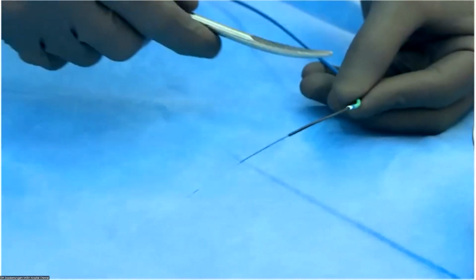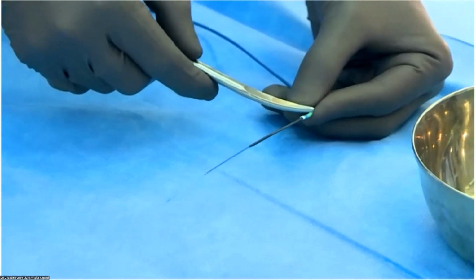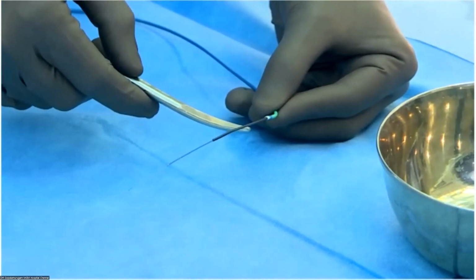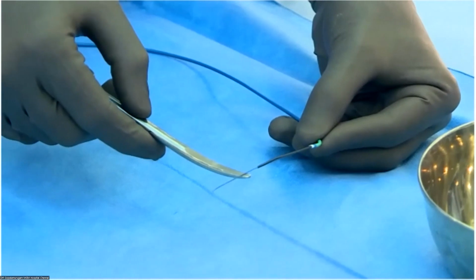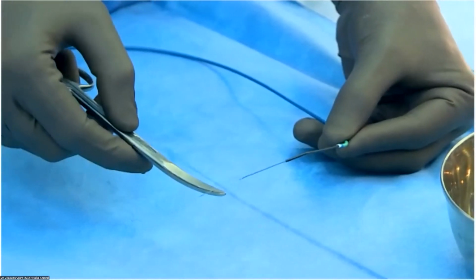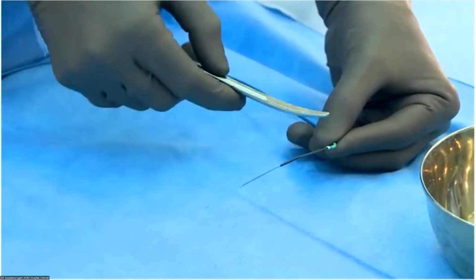So what we've done is, this is a JR guide. Into a JR guide, we have put a 4 French vertebral catheter. Into the 4 French vertebral catheter is a Fine Cross microcatheter, and through the microcatheter is an Astato 20 wire. So I hope this makes sense. This is the coaxial system.